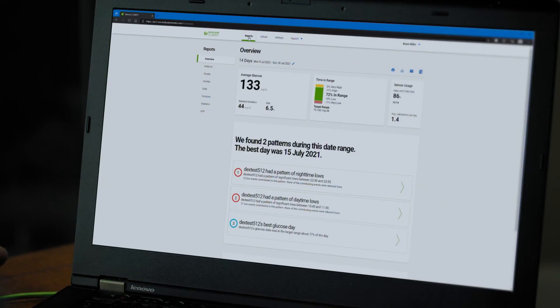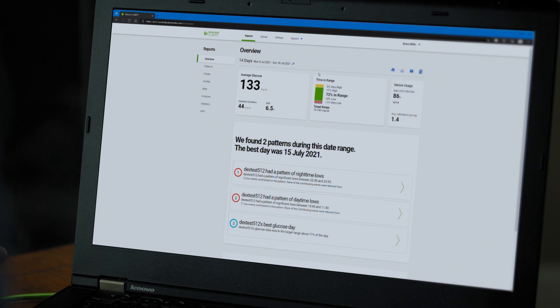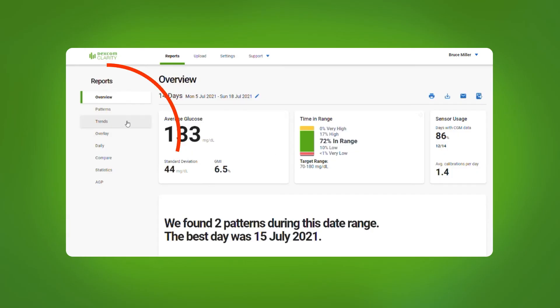Use the Clarity Overview page to check your average glucose and to see how often you're staying in your target range. You can use the menu on the left to view different types of reports.